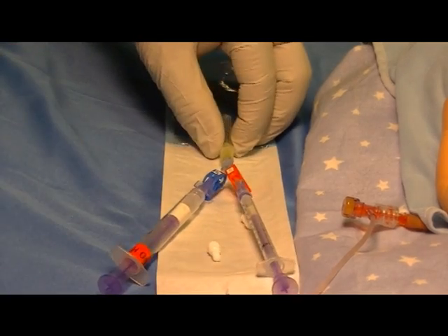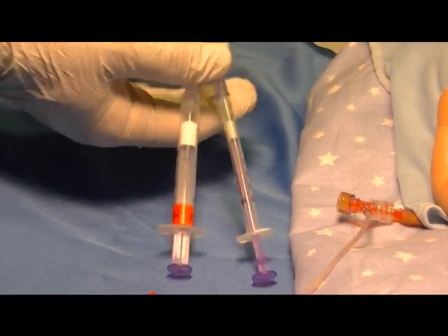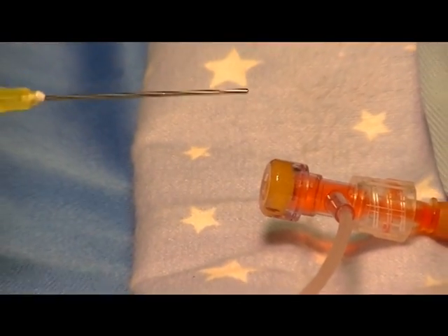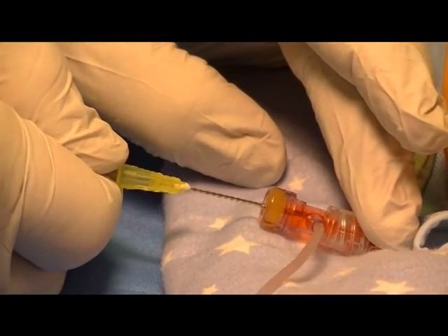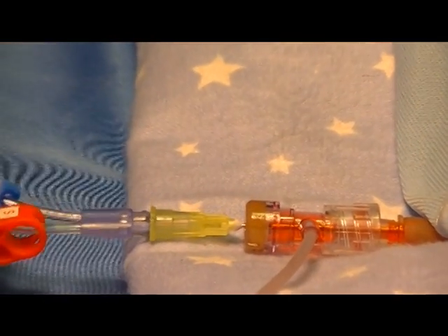Now you're ready to insert the Humi micro draw into the T-connector. Go to bedside, remove the sterility cover, and insert the Humi into the T-connector until it fully seats to the full depth of the blunt tube.